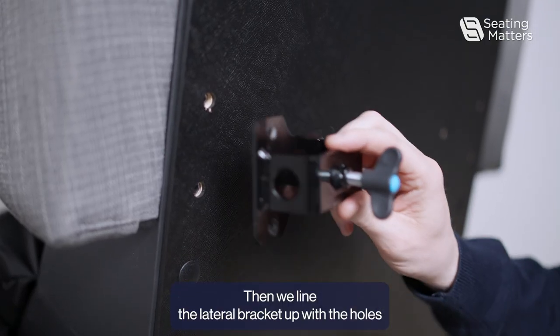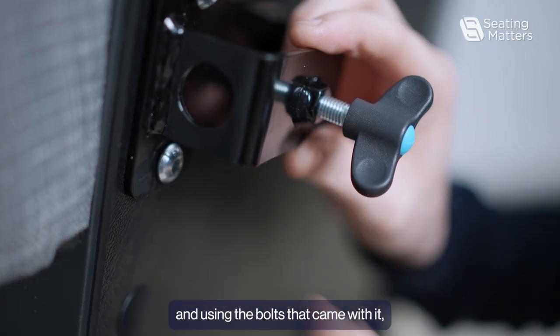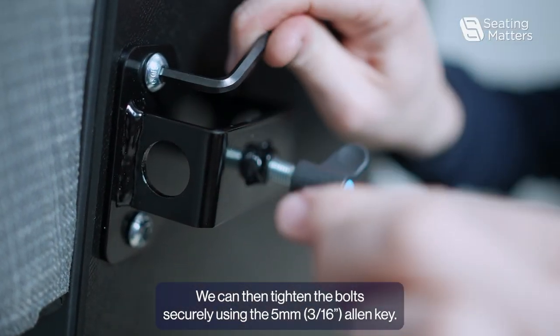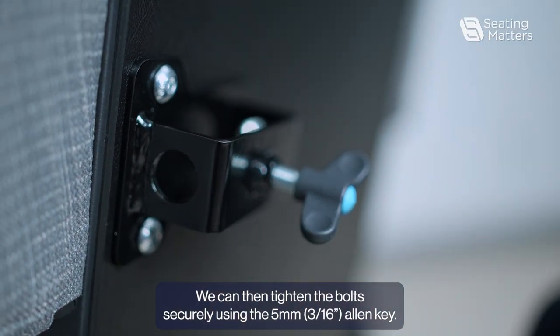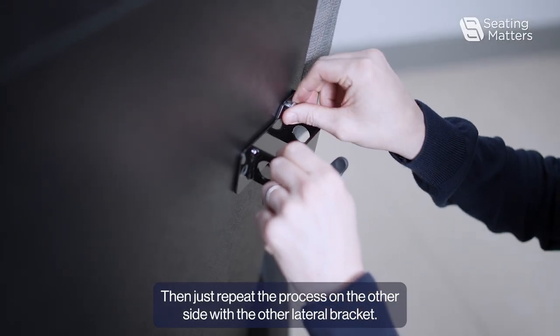Then we're laying the lateral bracket on top of the mount, and using the bolts that came with it, screw them into place. We can then tighten it securely using a five millimeter key. Then just repeat the process on the other side for the other lateral bracket.